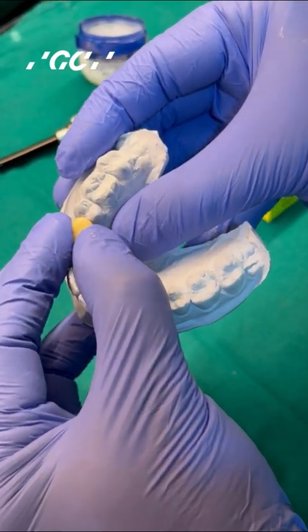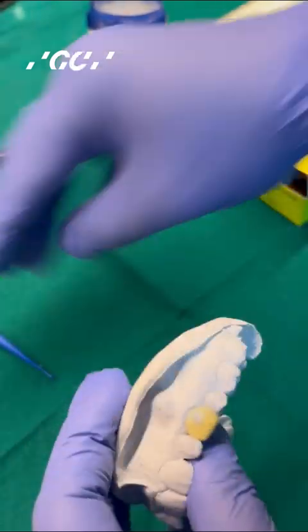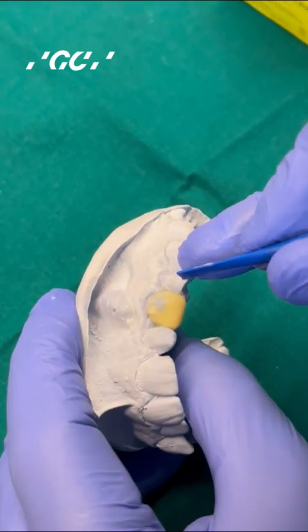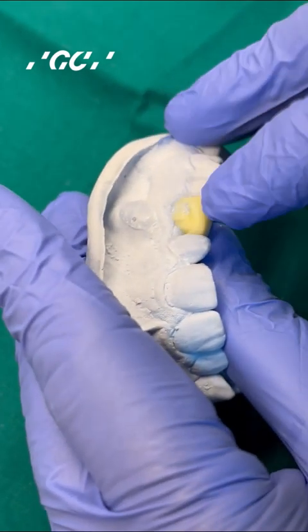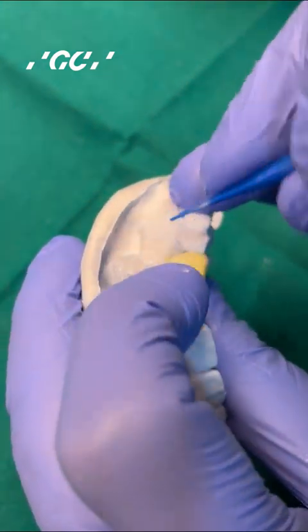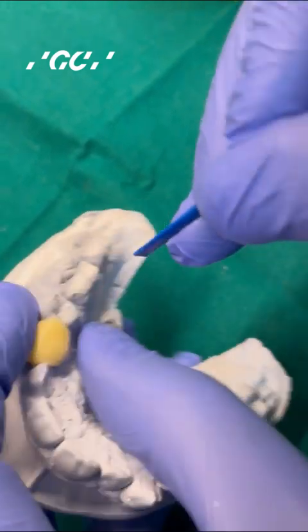With your thumb and forefinger, you gently move the resin buccolingually. Then with the same instrument, you can give it the desired anatomy. This material will not set till the time you expose it to light, so you have a lot of time to work with it. In the patient's mouth, you can ask the patient to bite and that will register the occlusal anatomy of the tooth.